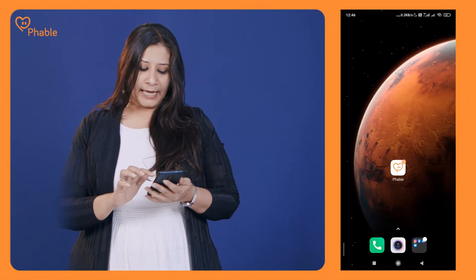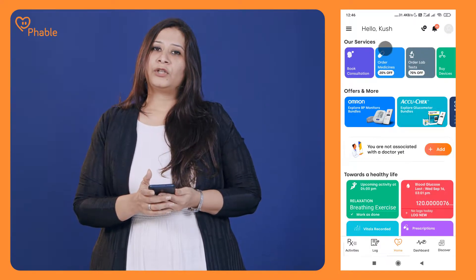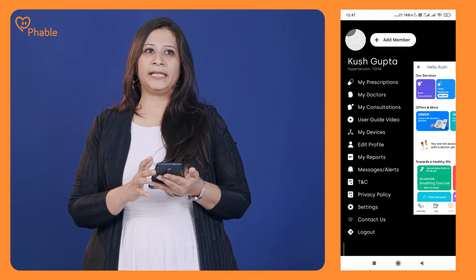All you need to do is integrate the device with the Fable app. To integrate, you'll have to install and register on the Fable app. Once registered, visit the app — you will find a menu button on the top left corner of the screen. When you click on it, you will see 'My Devices'.